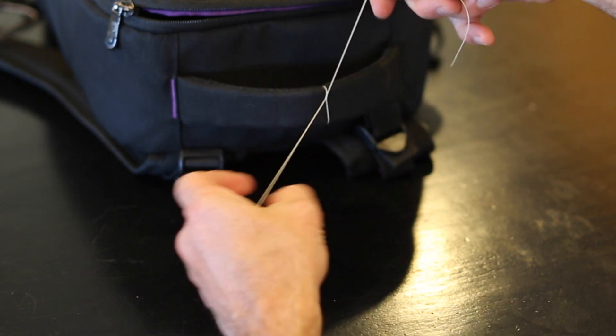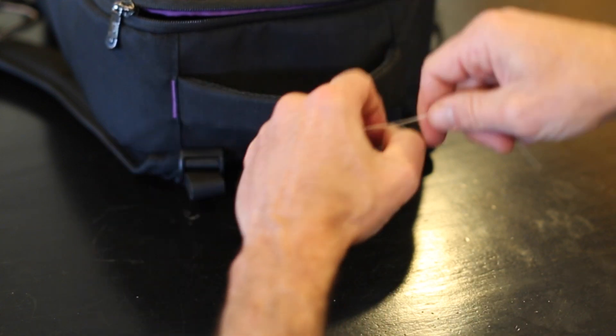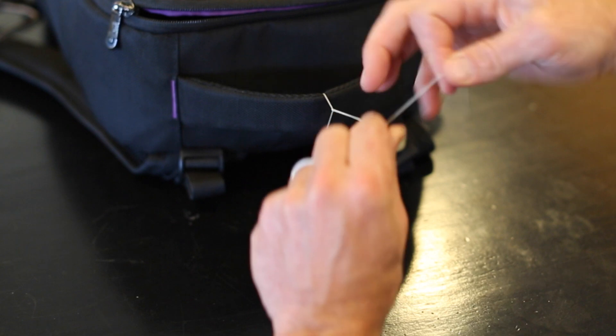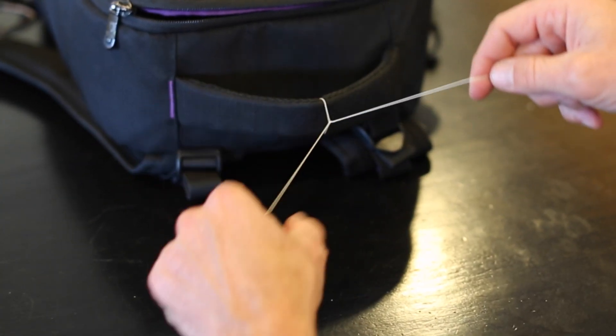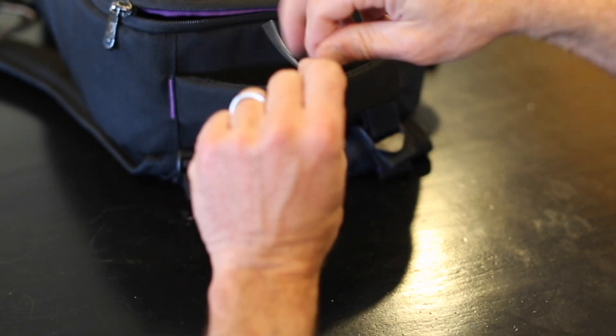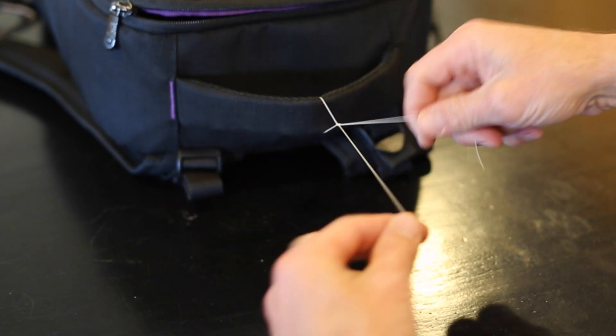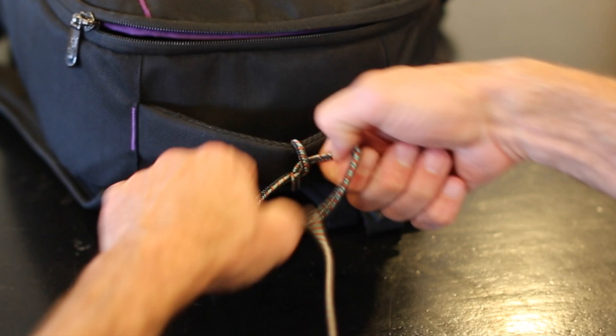This is just a normal suture. When you're messing around, that's when it can get loose, and if it's loose when you tie it, you kind of get this loose tie right there. Sometimes you don't want that, and that's why you do a surgeon's knot to get it really tight.